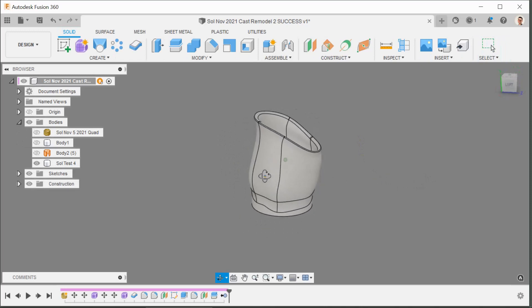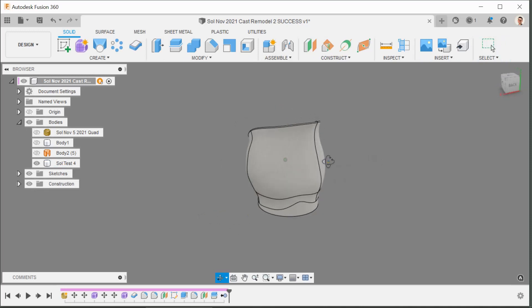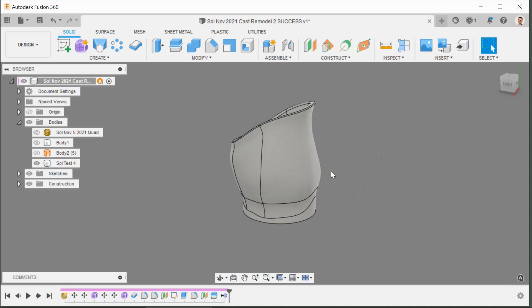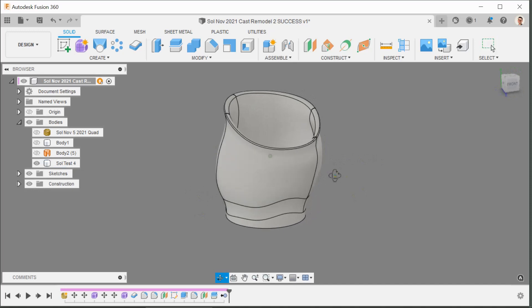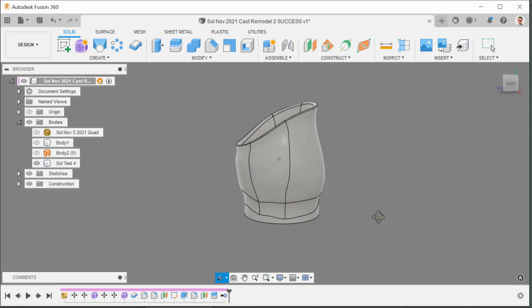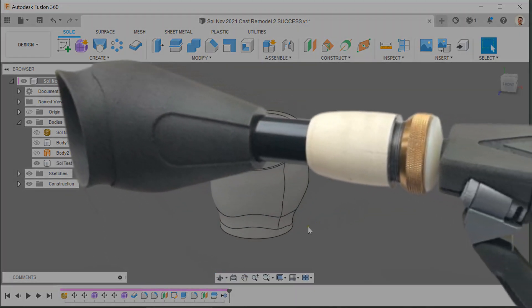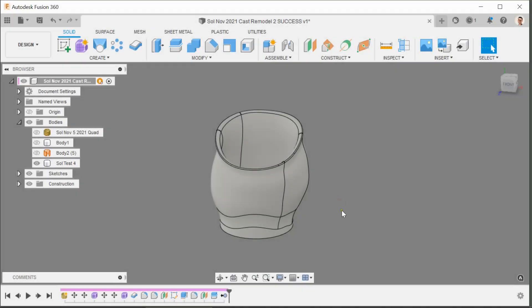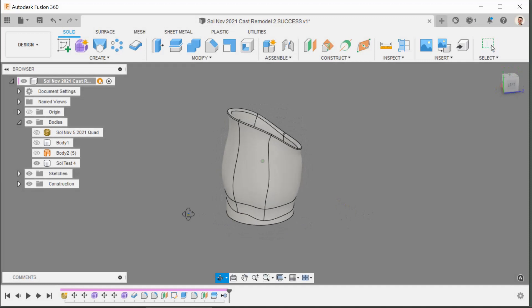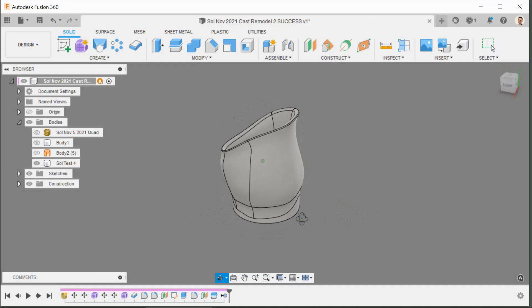That's the next test socket we're going to try. Sol will wander around the house putting his weight on it for maybe 20–30 minutes and see how it feels. If that's good, we might try the same thing for the condyles and come in a bit more snug. It's a very incremental process — small changes at a time — because printing the final vario socket could be a 9-hour print with significant material and electricity costs.